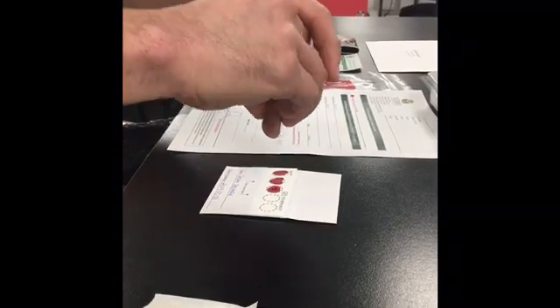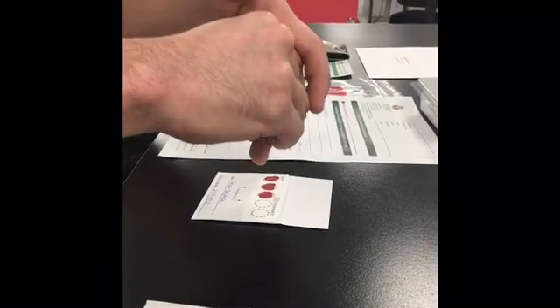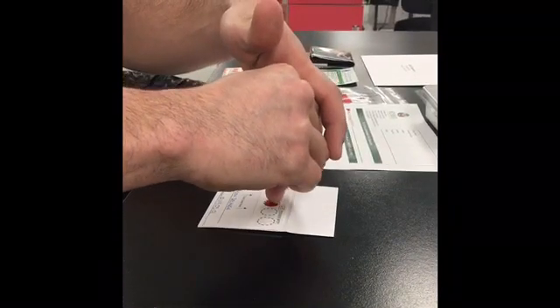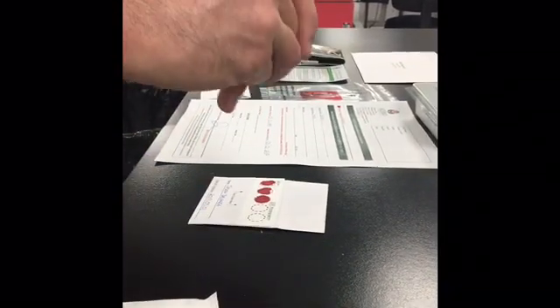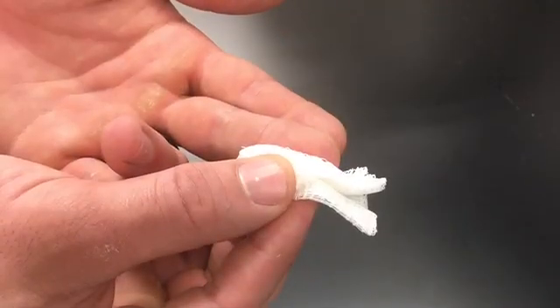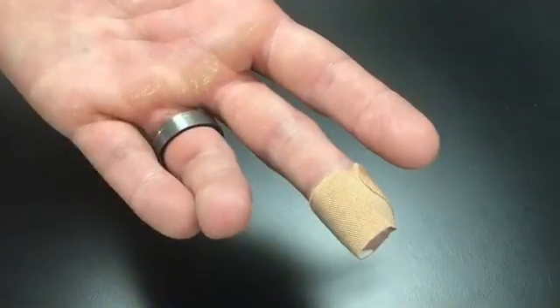Five full circles are required for testing. Do not allow your finger to touch the blood spot card. When all five circles are filled, apply pressure to the puncture site with the gauze and bandage the finger.